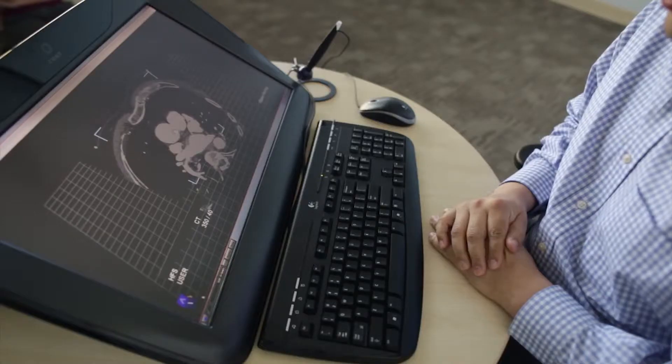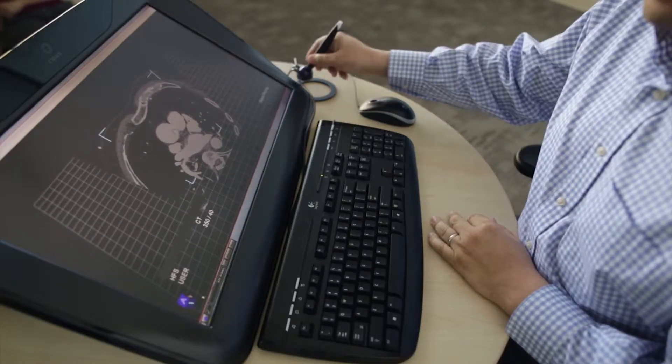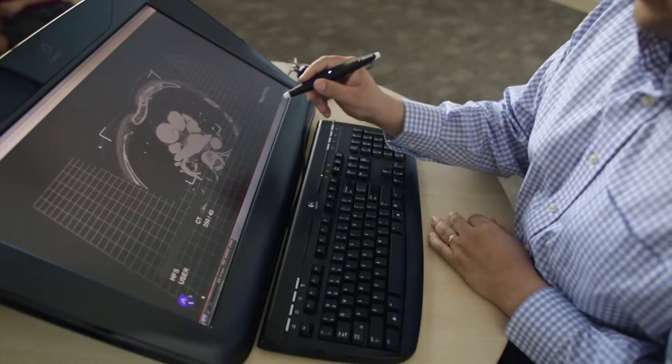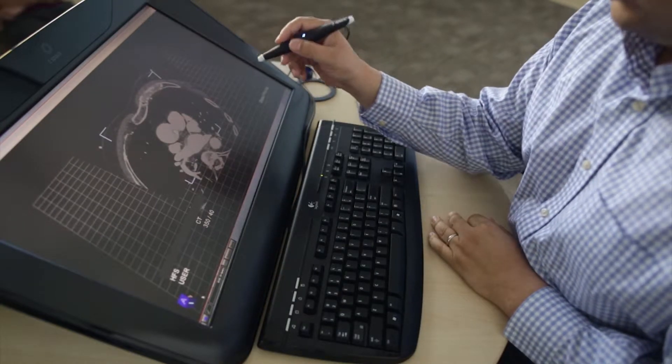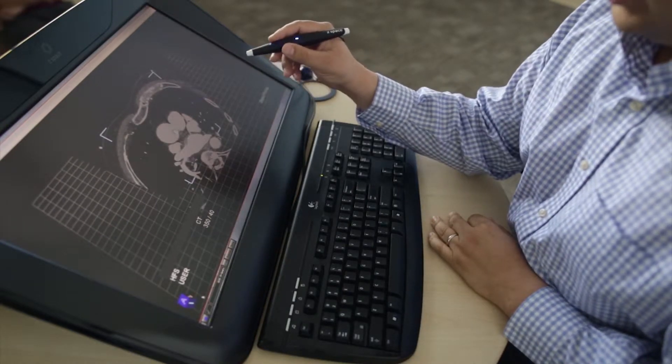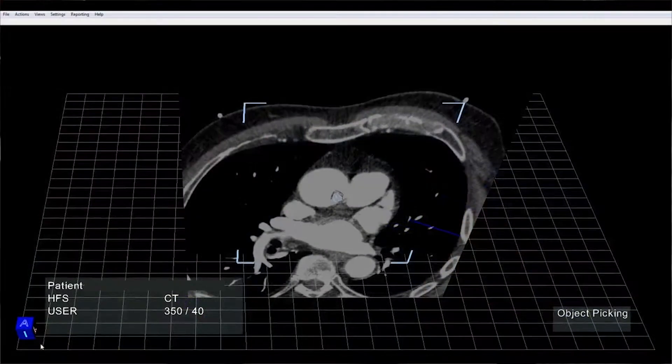After you load data, what you'll see is your data loaded in the middle of the screen, and it'll start with a 2D view, so you're seeing an axial 2D slice.